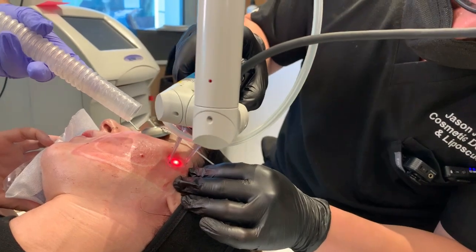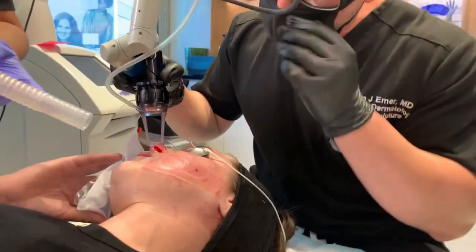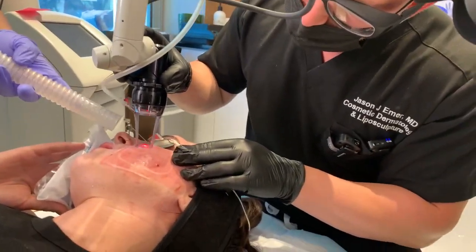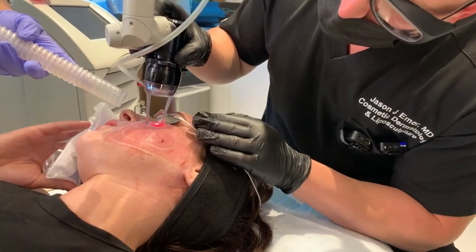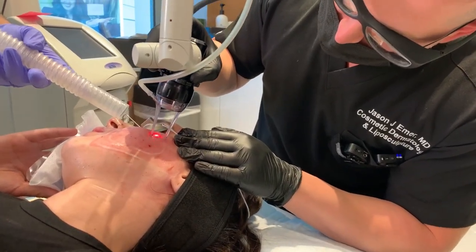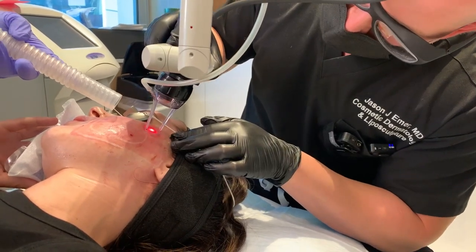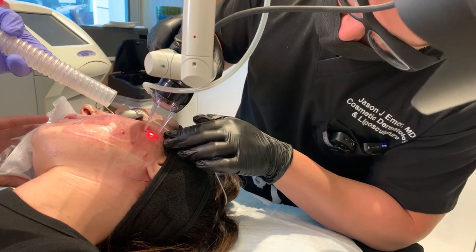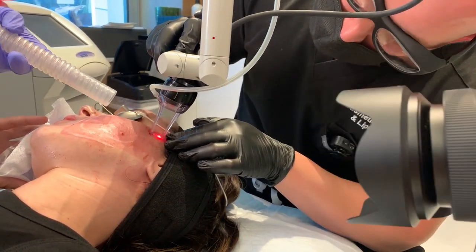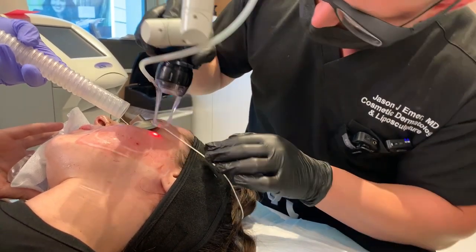Here's the thing, you guys. Scarring takes a combination. It also takes multiple treatments. She's had this done once before with amazing results, and now we're doing a bigger treatment again before she goes into her maintenance phase. This is one of those lasers where you have to have patience because there's risk of hyperpigmentation. It takes a long time to see the results of this. So a lot of my patients that either have issues with lasers or results is because they don't have as much of the patience.